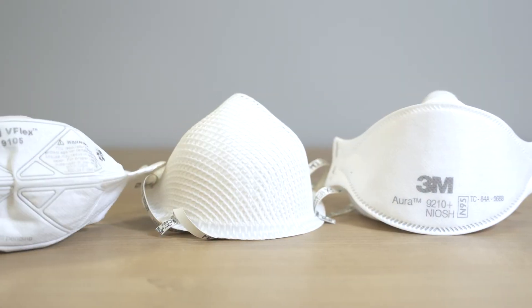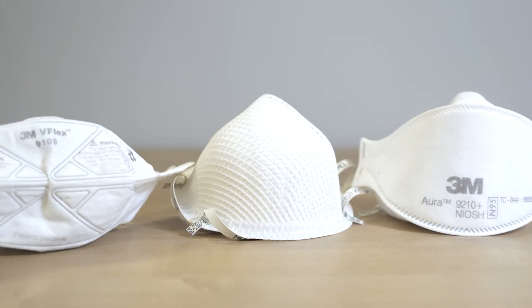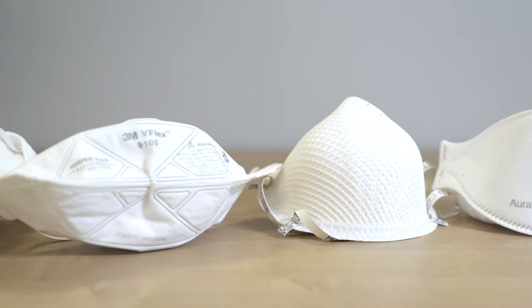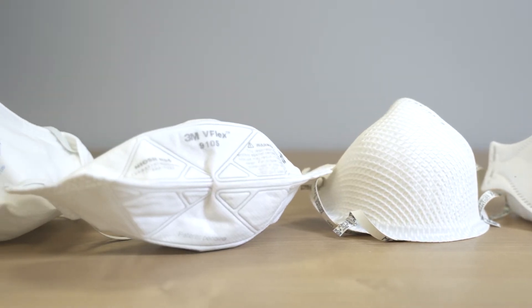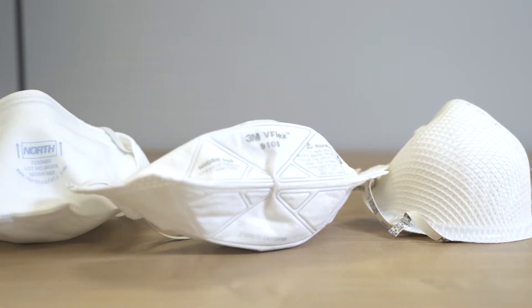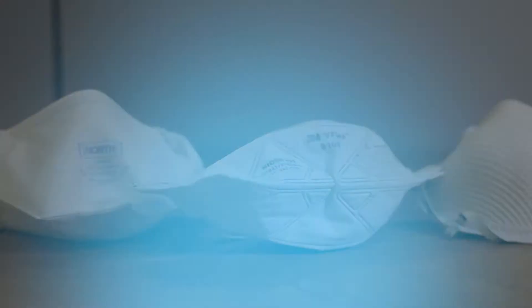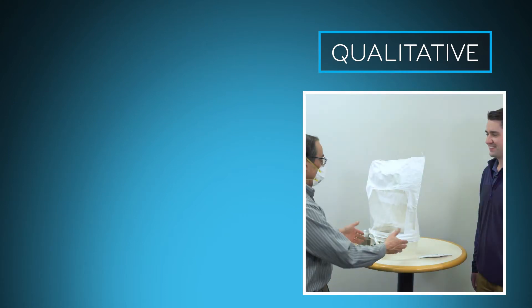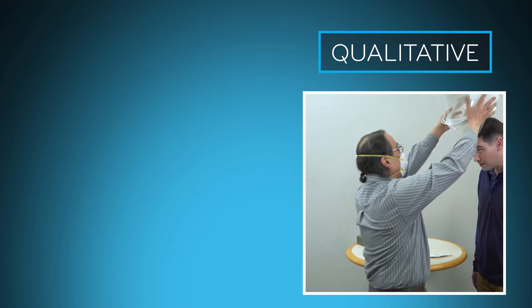For this comparison, we will show you a successful fit test with each method on an N95 filtering face piece. To begin, for the qualitative method only, a threshold screening is required to evaluate the respirator wearer's sensitivity to the challenge agent.